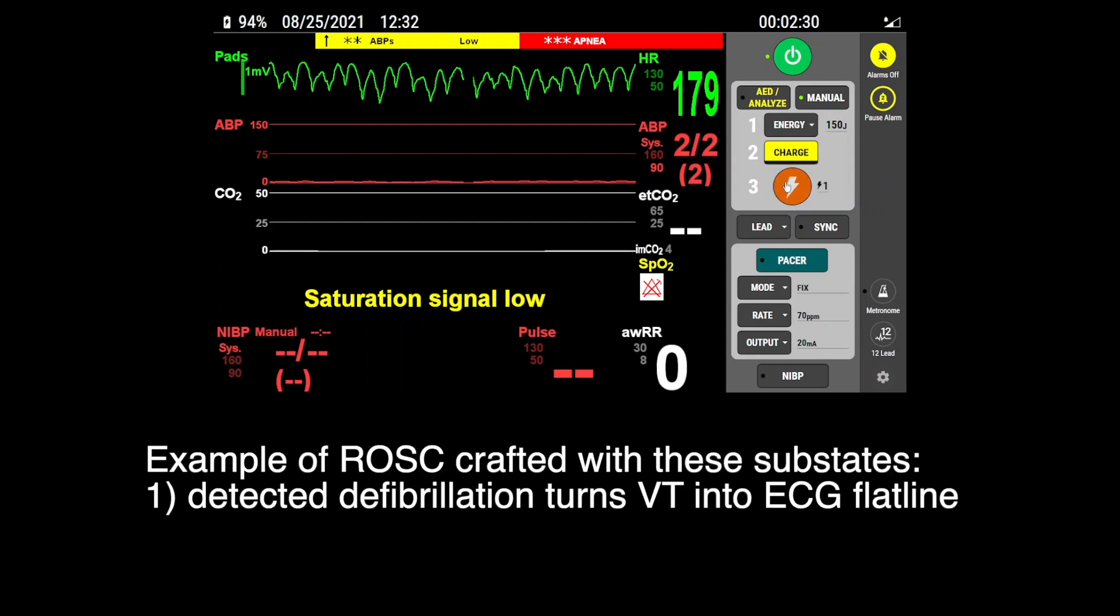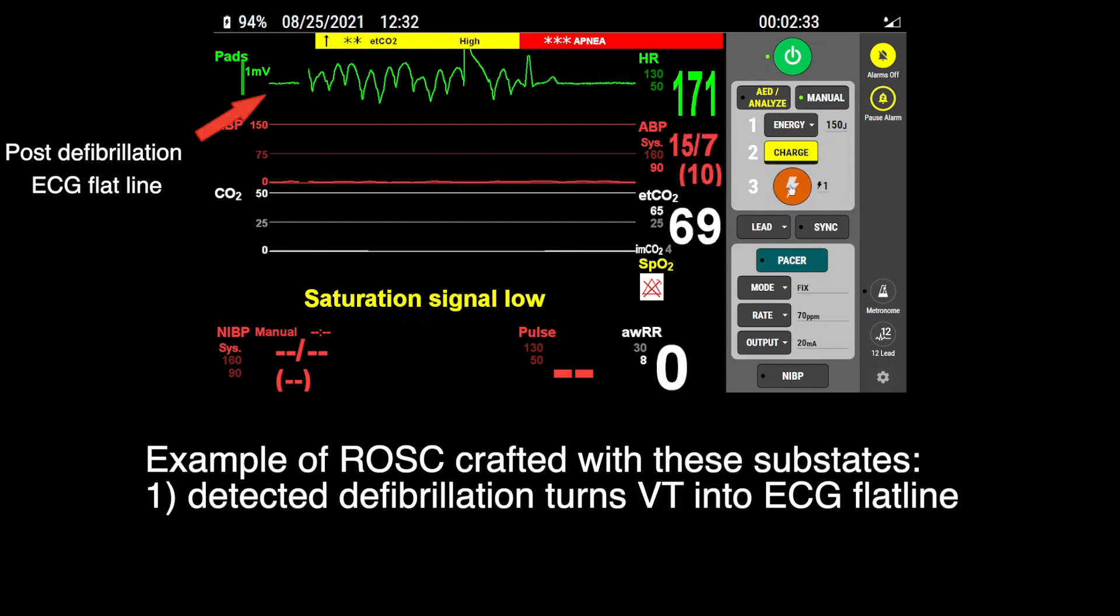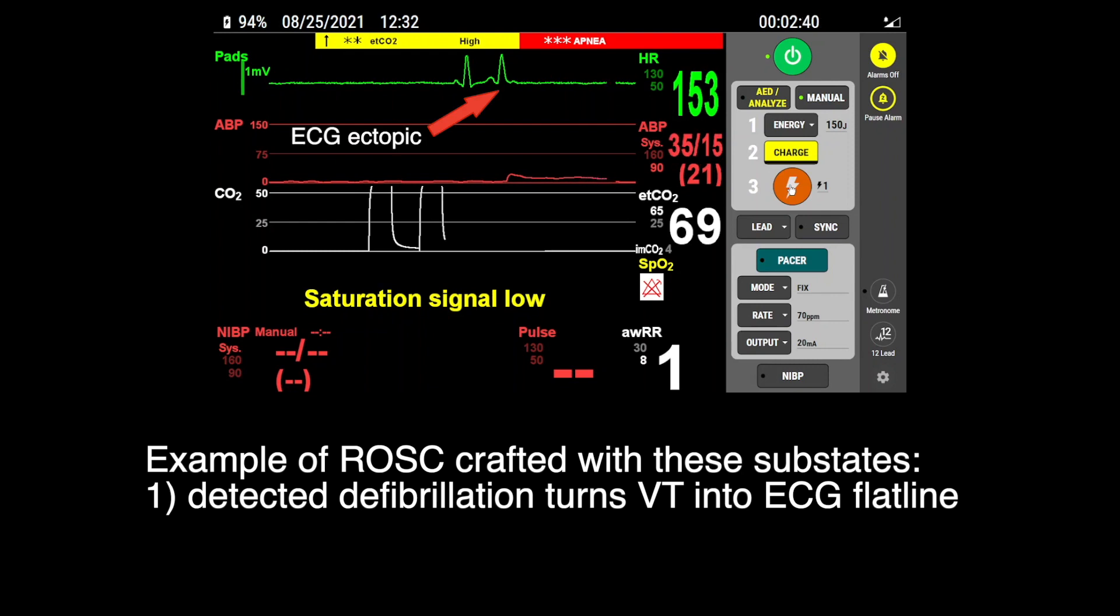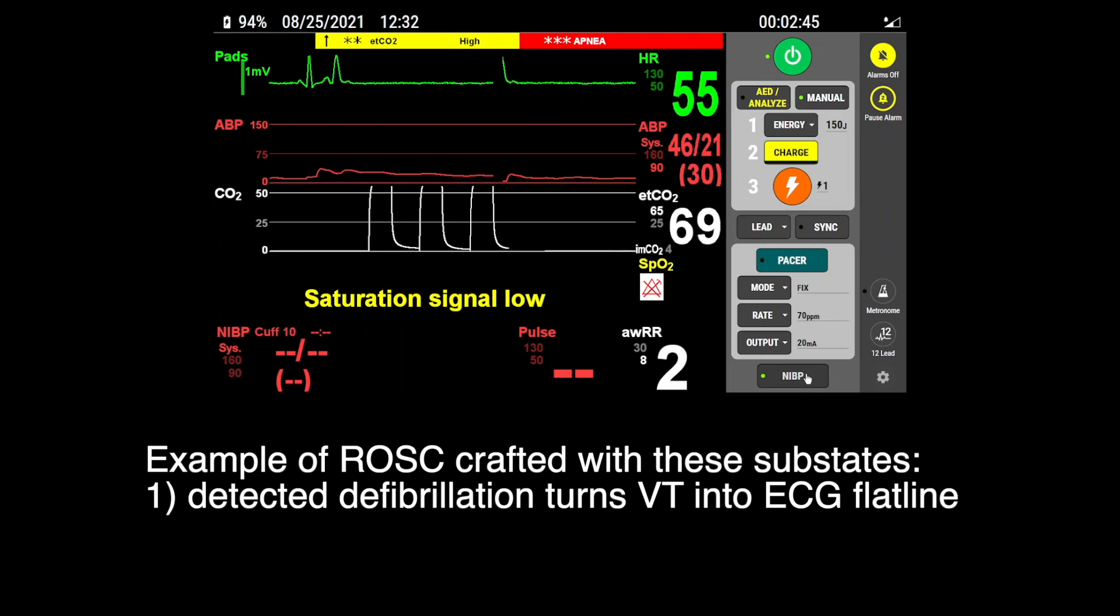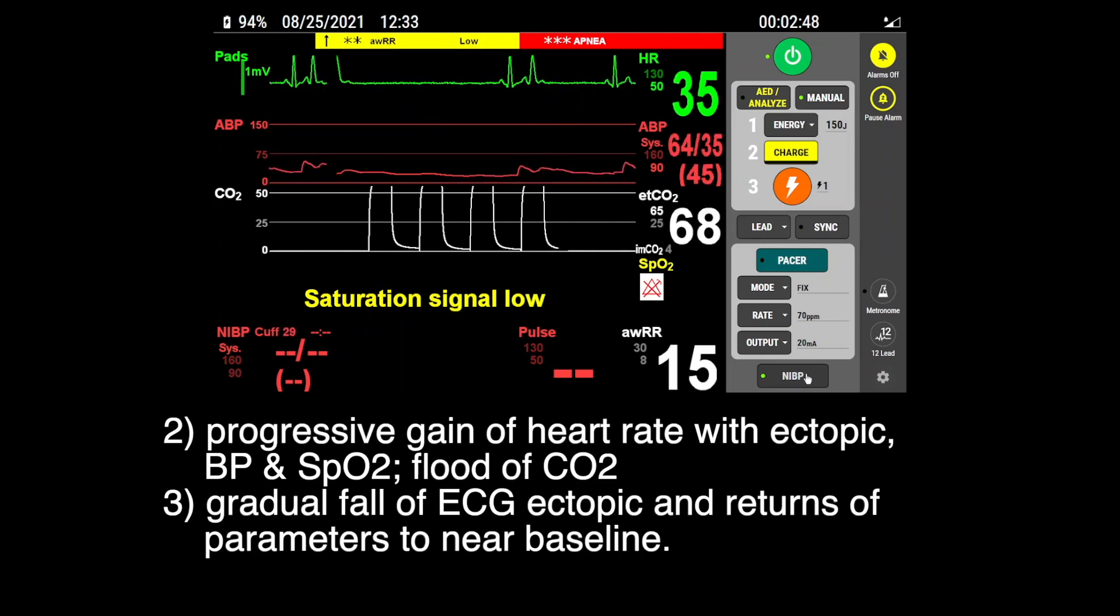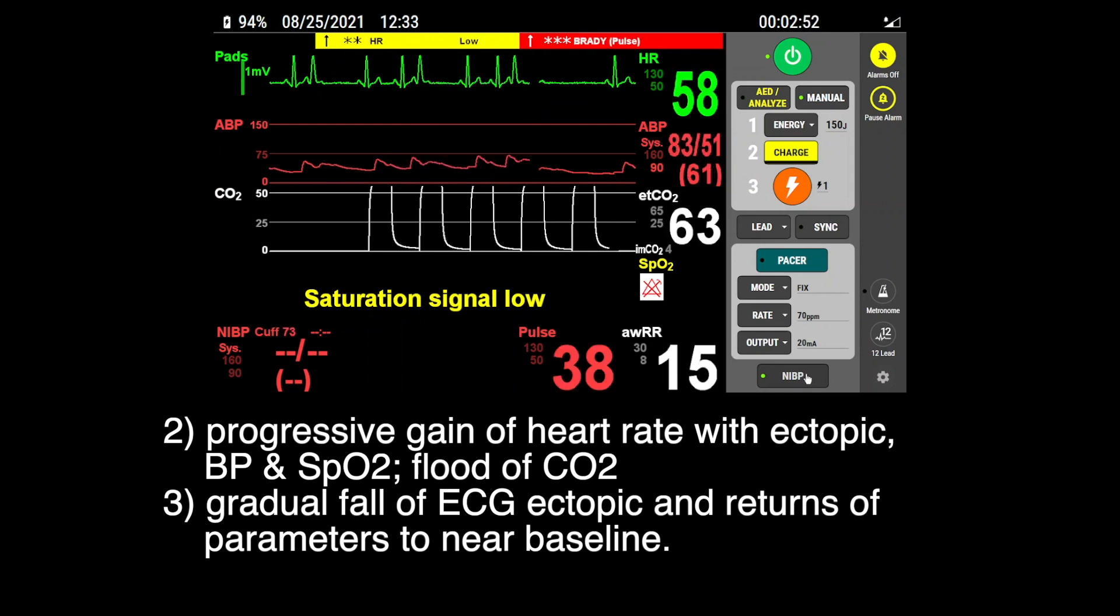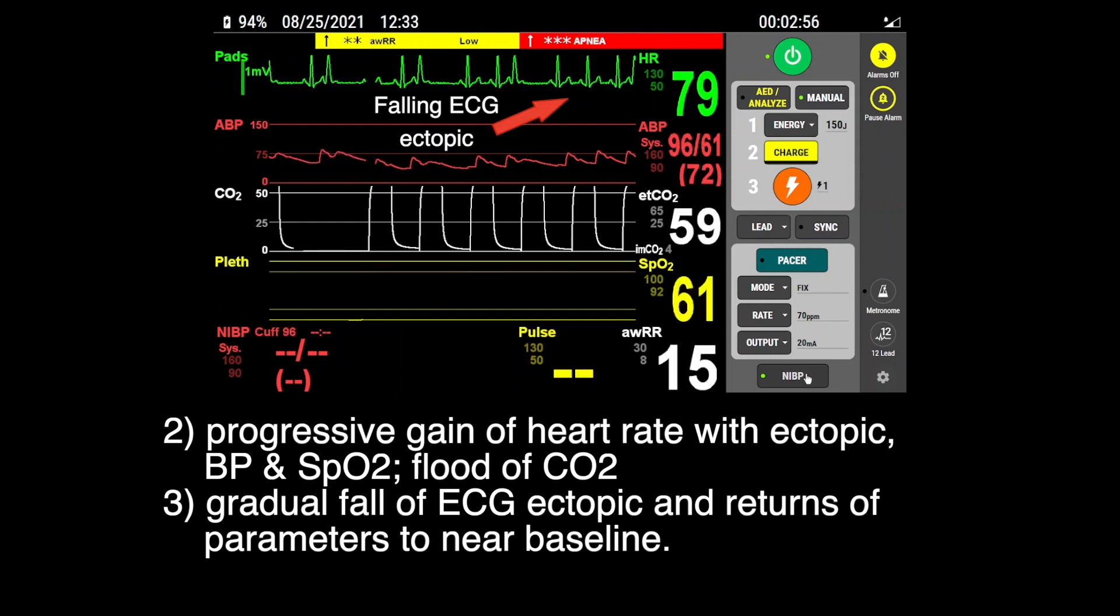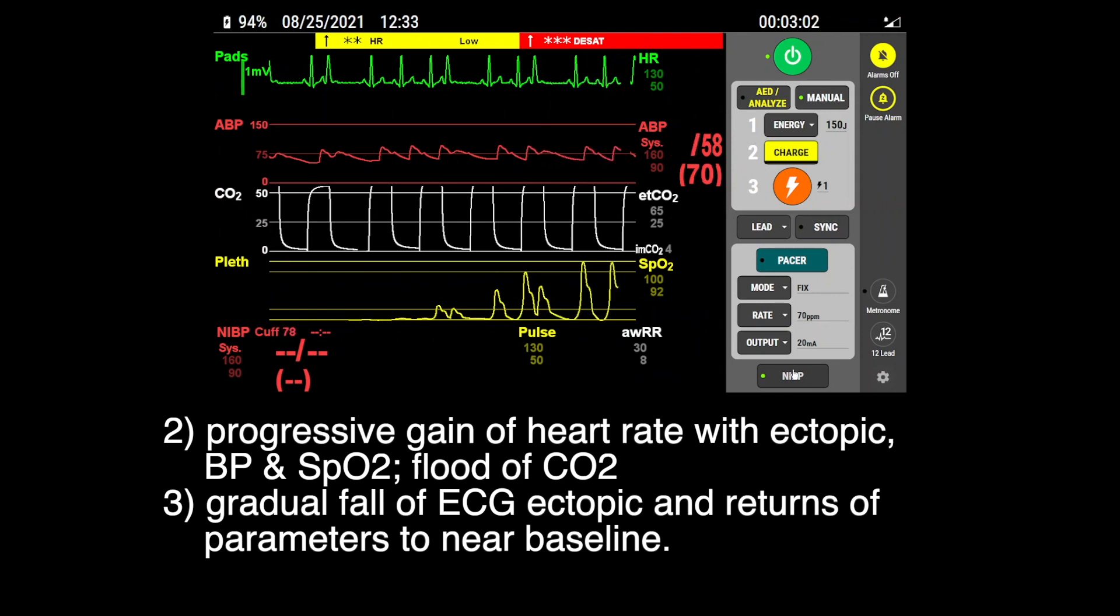Examples of ROSC crafted with these substates: One, detected defibrillation turns ventricular tachycardia into ECG flat line. Two, progressive gains of heart rate with ectopics, blood pressure, SpO2, end-tidal CO2. Three, gradual fall of ECG ectopics and returns of parameters to near baseline.